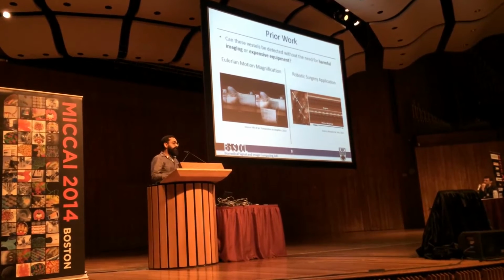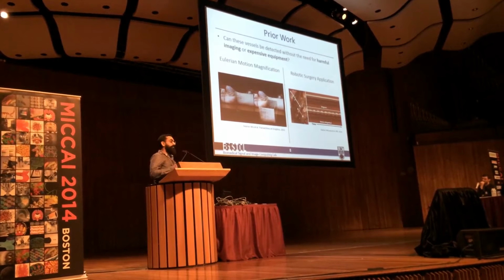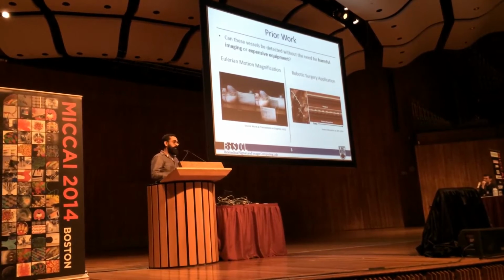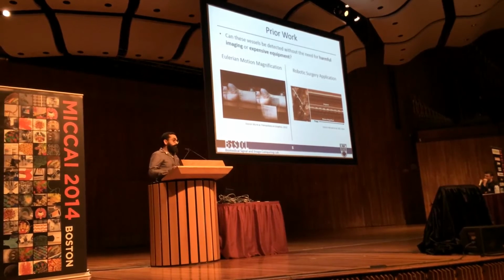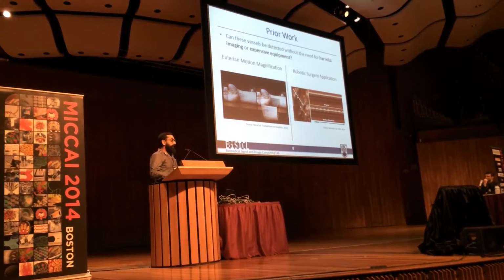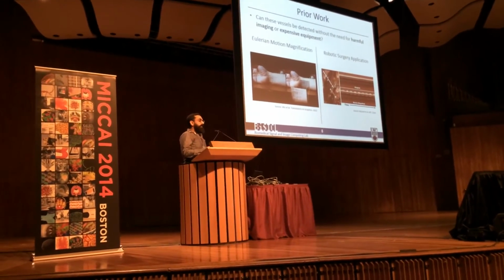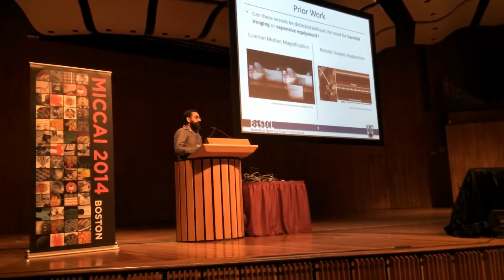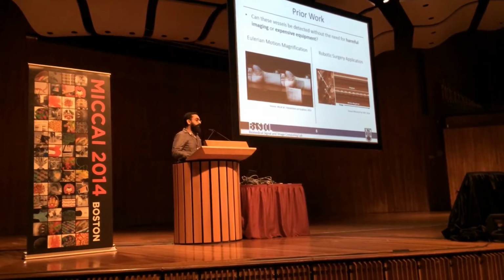However, the emphasis of motion doesn't really attract the surgeon's attention to location where the vessels are. So we hypothesize that if we can identify and enhance motion of vasculature, we should be able to label it accordingly. And labeling became a very important goal for us because the artificial motions applied to surgical videos was perceived as a nuisance by our collaborating surgeons.